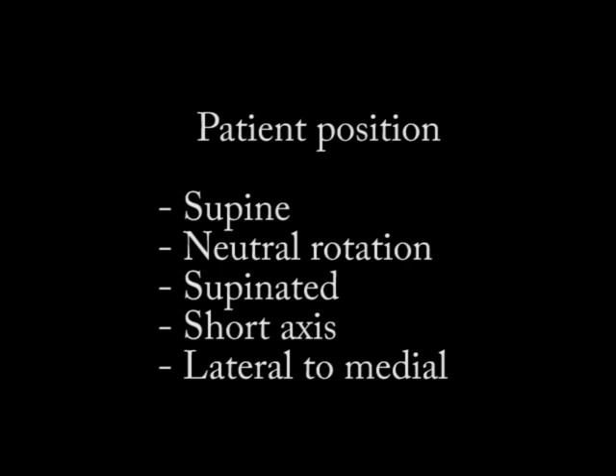For patient position, I prefer the patient supine. Their shoulder should be in neutral rotation. I often have their forearm supinated. I have the probe in transverse or short axis, and typically I'm injecting from lateral to medial, although you can inject medial to lateral.